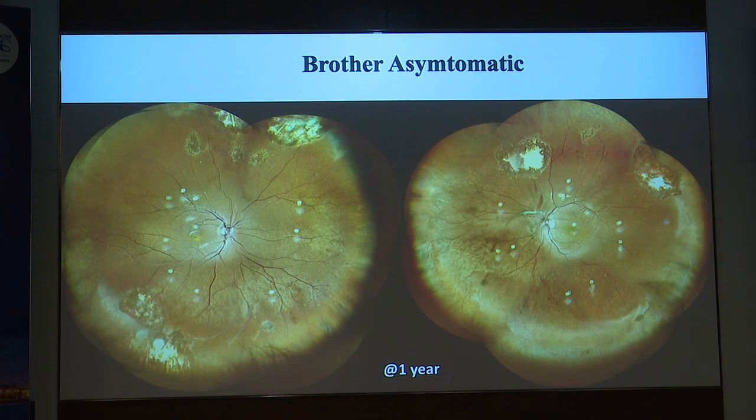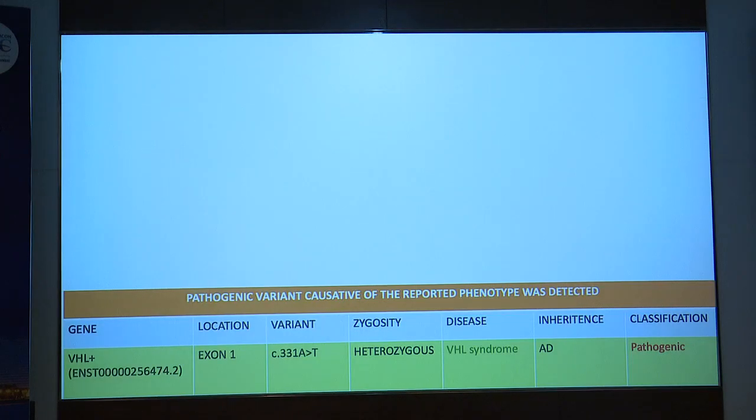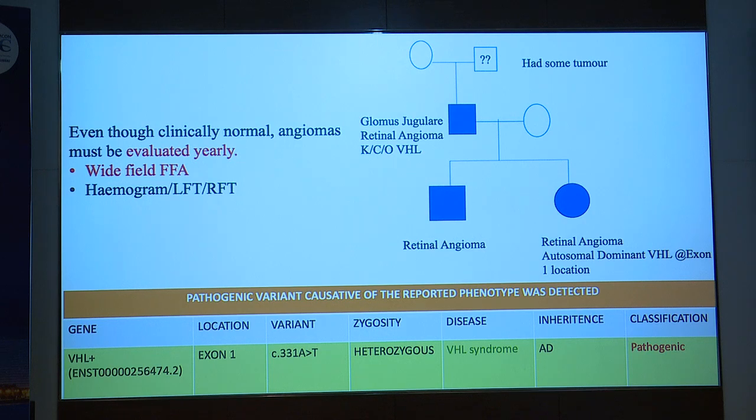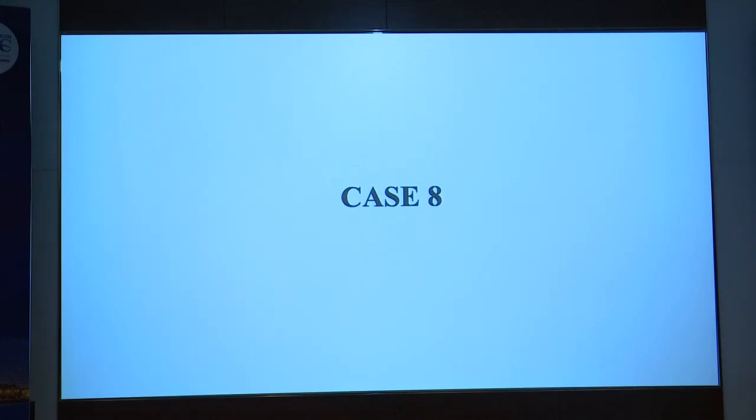Now we are going to do a yearly wide field angiogram for this patient. And what we learned, this is how we then did a genetic study and all. And this has to be done yearly only with wide field angiography. We would have missed it on a routine angiogram.